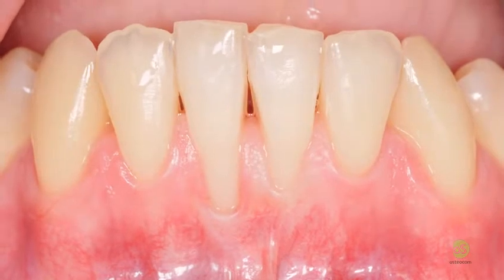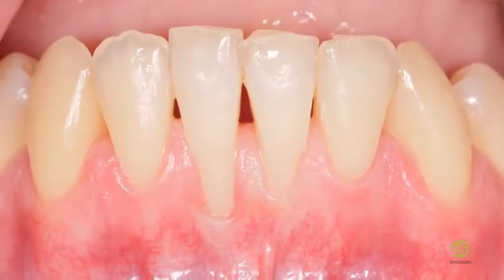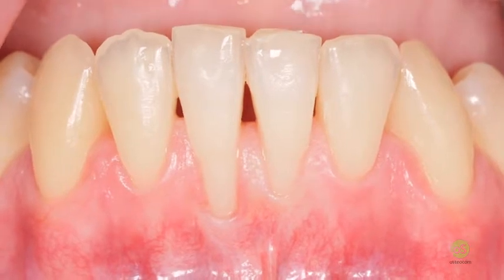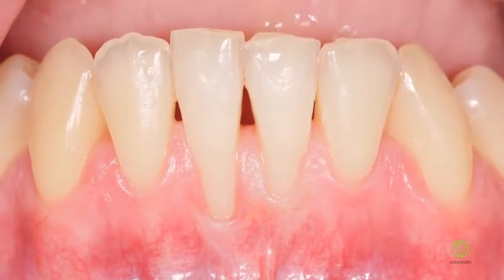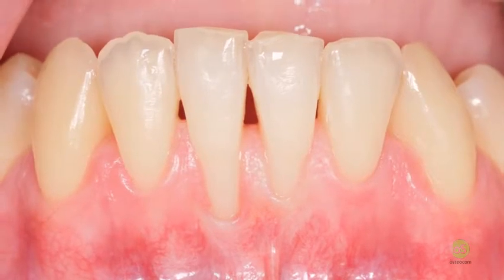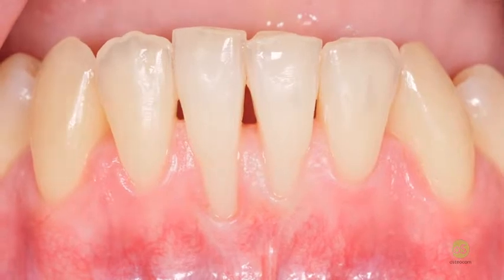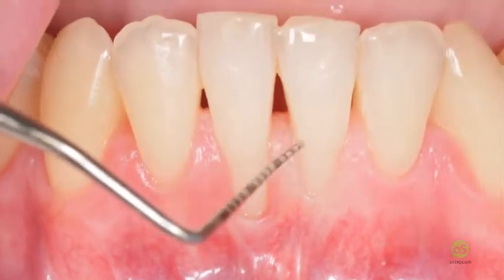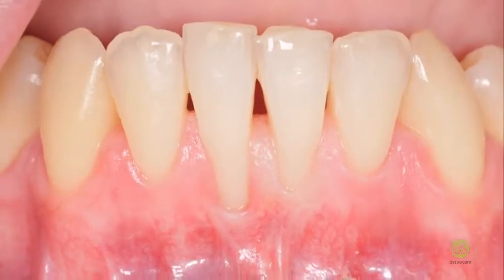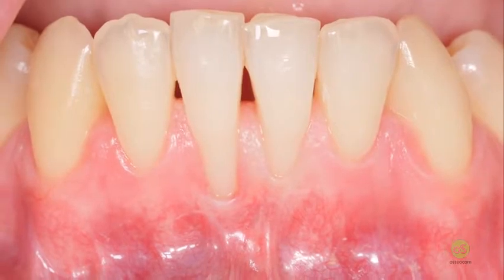This is the area to be treated. As you can see, there are 2 recessions at the level of the 2 central incisors of the lower jaw. Unfortunately, you can see that there is also some recession of the interproximal papilla, which will make the cement enamel junction a bit exposed, and so the predictability to cover completely this recession is highly reduced.